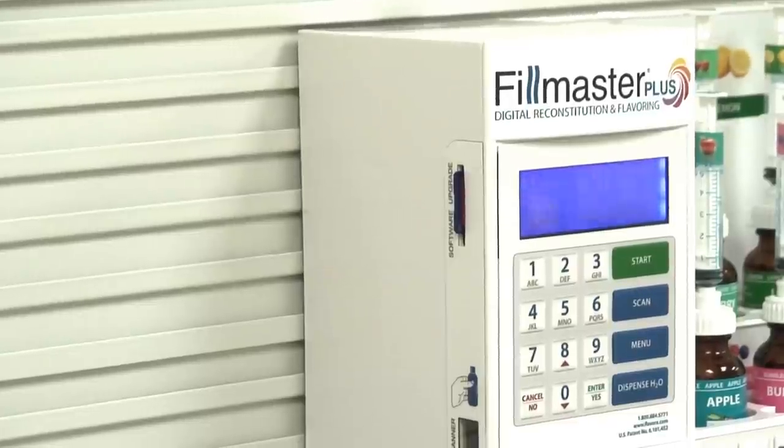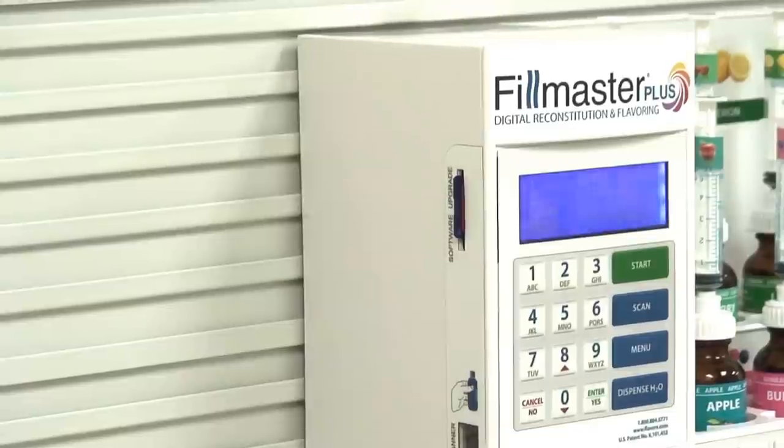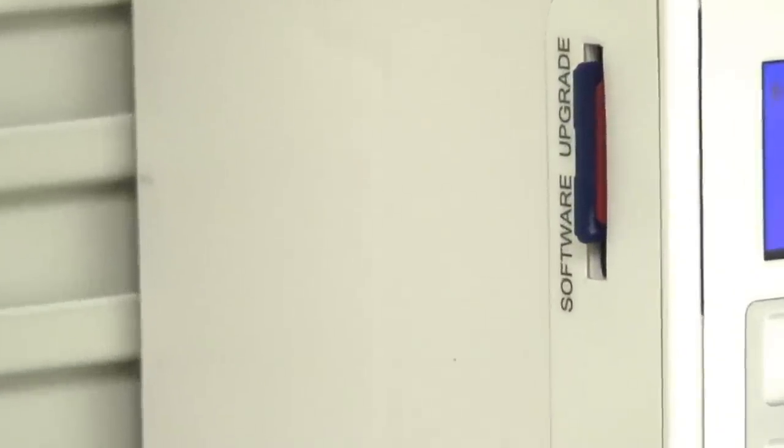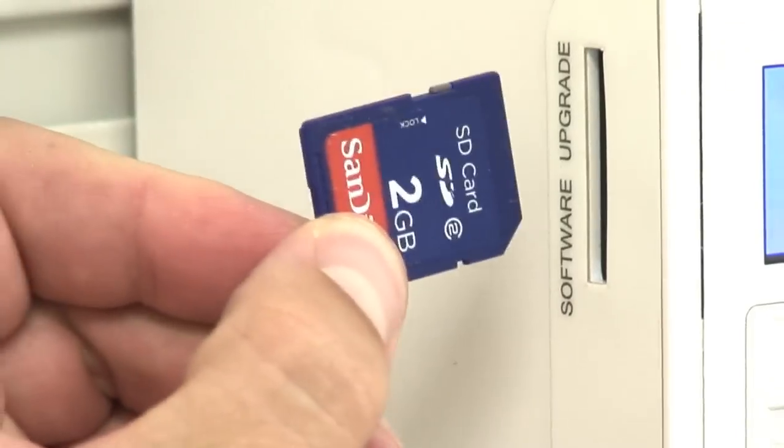The Filmaster Plus has several unique features. The first is an integrated SD card, which contains reconstitution and flavoring data for all liquid medications. The card allows for easy updates to the machine.